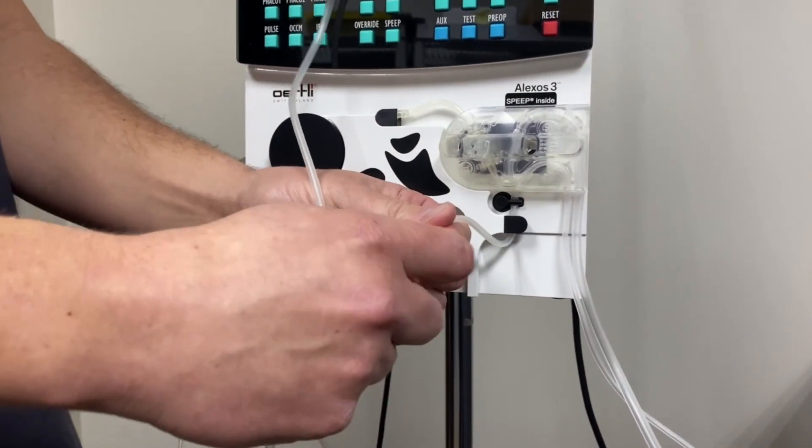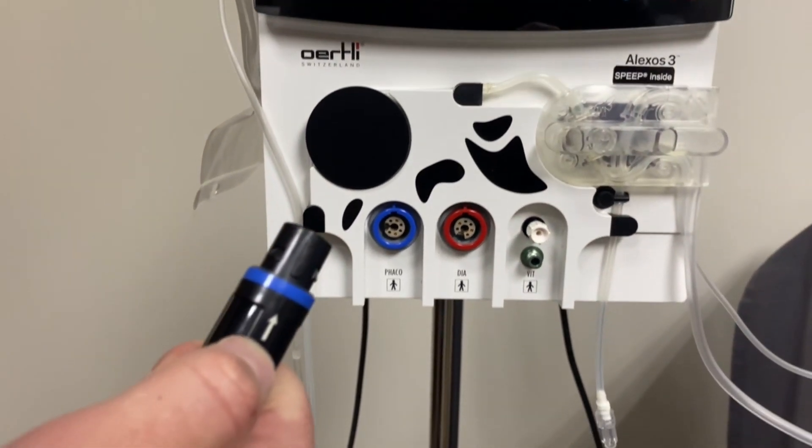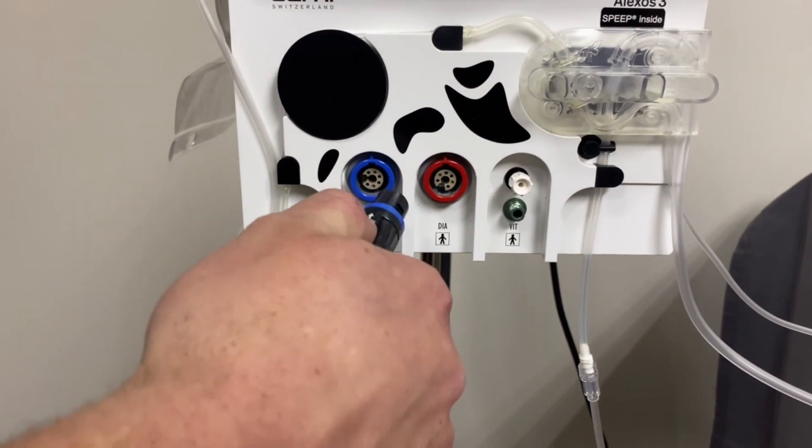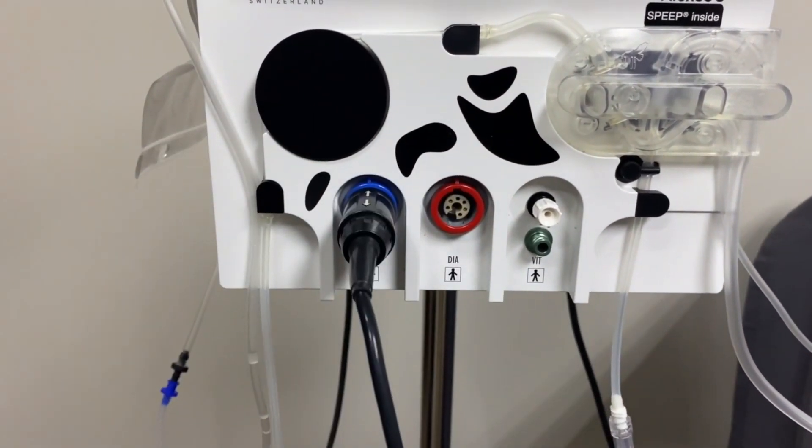Connect the FACO handpiece to the Alaxos 3 device. The plug of the FACO handpiece has a blue ring that matches the plug with the blue ring on the machine. The arrows must be visible once connected. Please note that the tubing that connects to the FACO handpiece must be kept sterile.